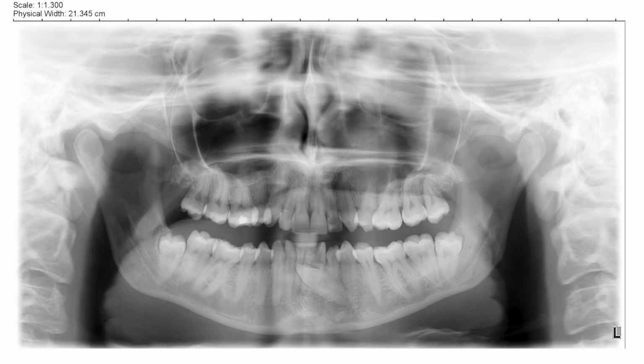So I'm looking at my laptop down here. I have here in front of me my x-ray, and I'm going to put it on the screen for you now, and I'm just going to talk to you about it. So what you'll see in front of you is an x-ray of my teeth. What you're looking at is the front two teeth in the middle there, and the x-ray kind of just flattens it all out, because the machine goes around like this. So it'll probably scan from left to right. It'll just do that and flatten it all out. So that's what you're seeing.